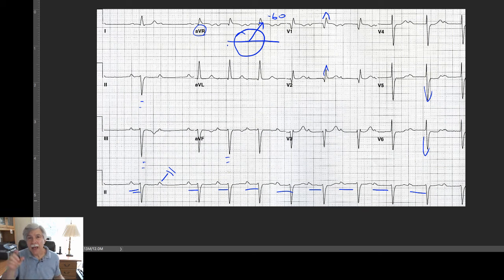It's just bifascicular block, and you have delay in the AV node itself. So it gets to be really tricky, and you can't just look at a tracing and say, trifascicular block, ha ha ha, I'm so smart. You really have to think about why you think there's trifascicular block, and some of it has to do with how the PR behaves. If it's variable, maybe it's AV nodal, but there's always the possibility that you have disease in that third hemifascicle that's causing the PR interval to get longer.